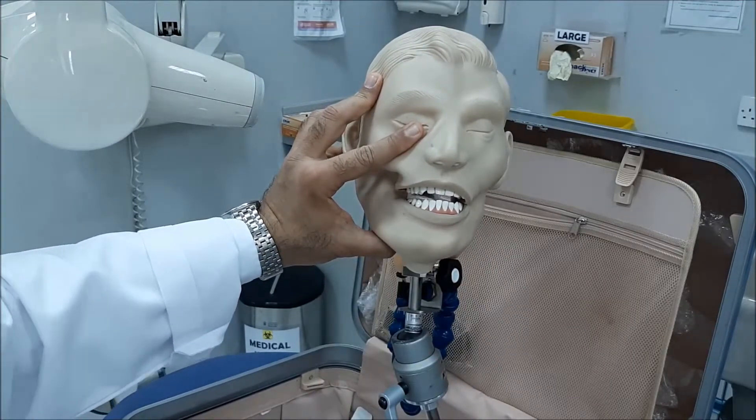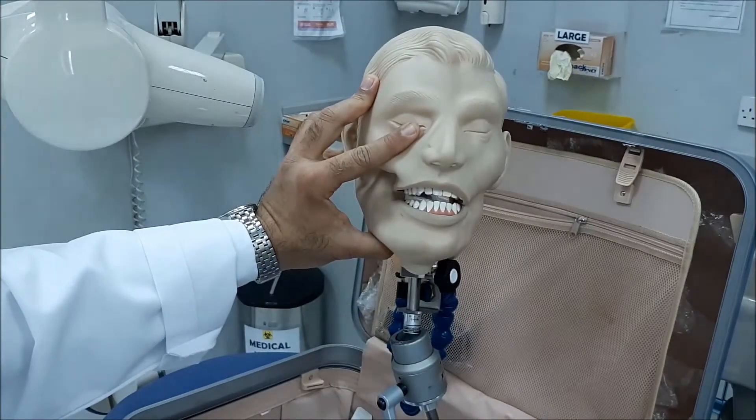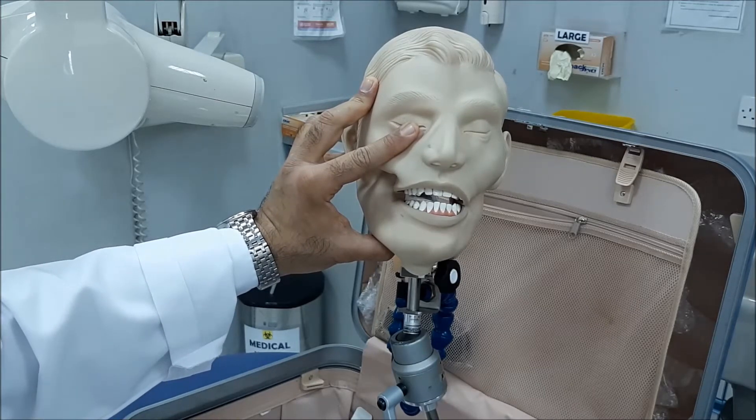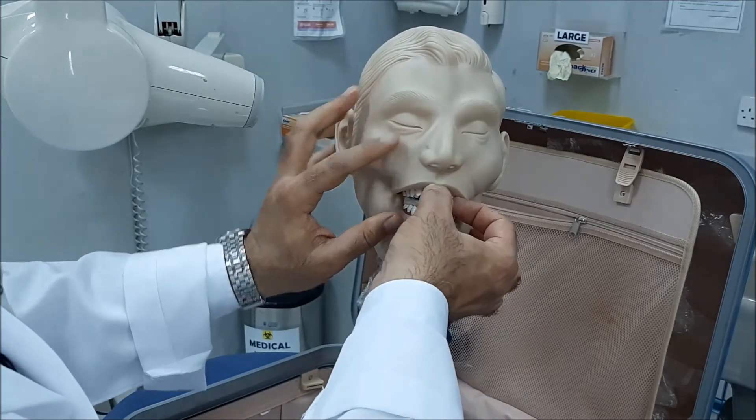Of course, since these teeth are present here, you will still have a gap. But otherwise, if the teeth are not present, you're going to just replace them with a cotton roll.